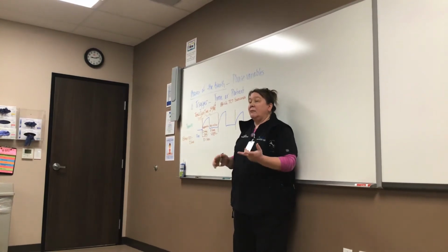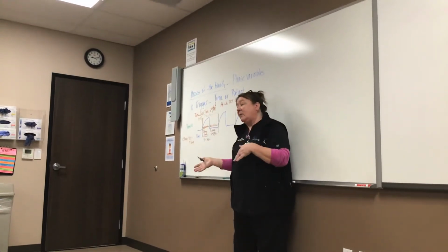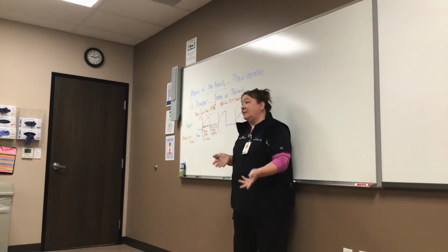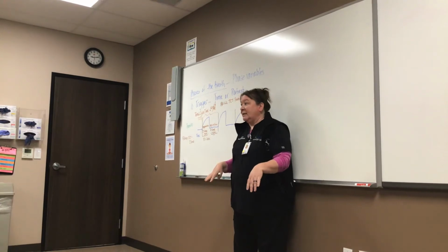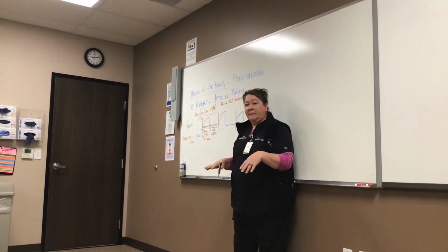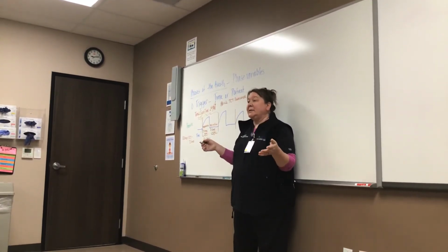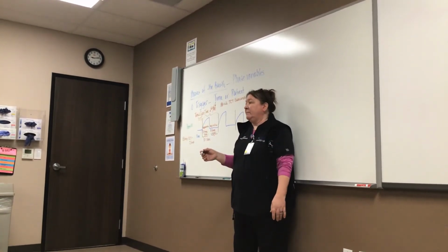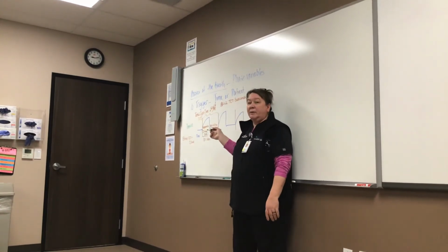You know how we'll talk about, next week, we'll talk about compliance. I don't necessarily worry about compliance that's too high, I worry about compliance that's too low. I'm not worried about if my E time is too long, I'm worried about if it's too short. So like if your I time is 1 second and your E time is 1 second, that's not normal. So E time is usually longer than I time? Yes, E time is always longer. On average, at a minimum, your E time should be 3 to 4 seconds, just to give you a number. But we would mostly look at whatever our I time is and let our E time be whatever it will be.